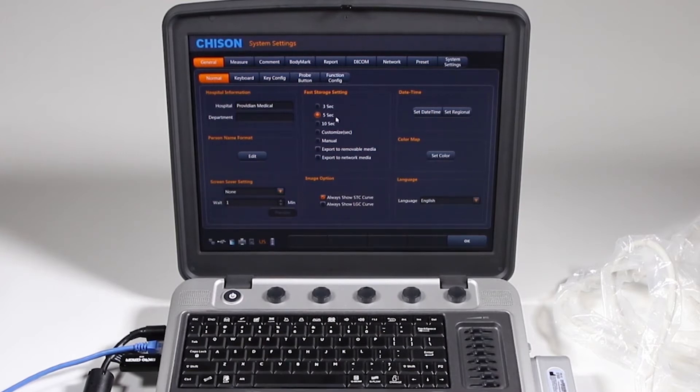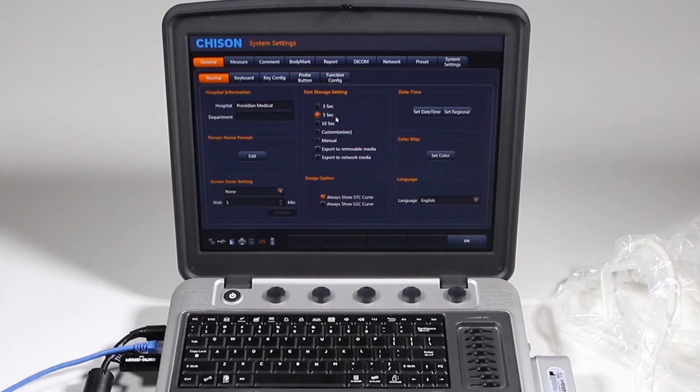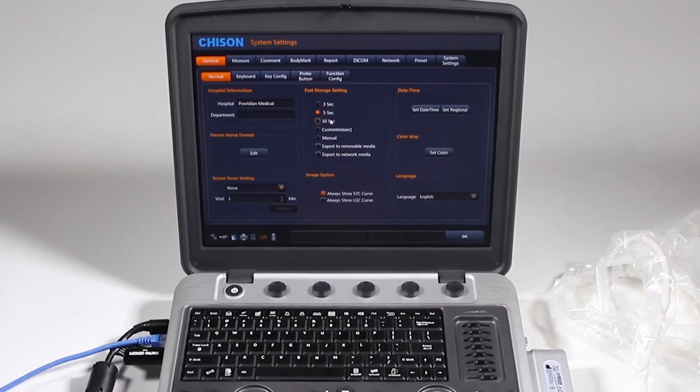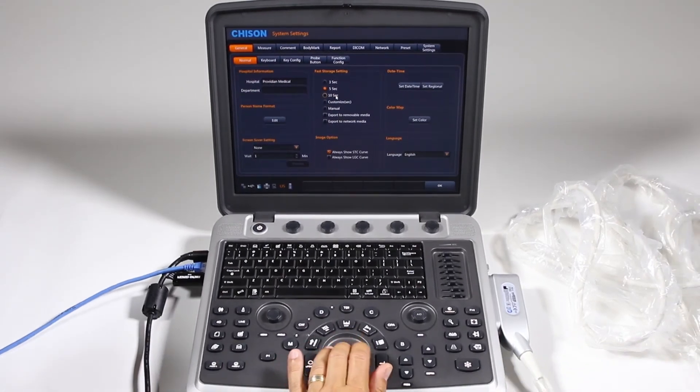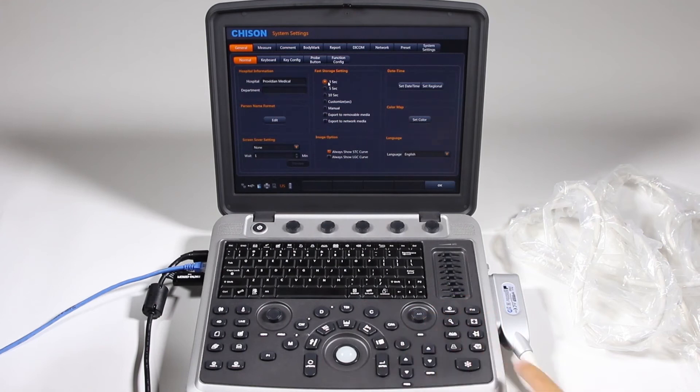Now this fast storage setting is for use during the CINE, like a prospective saving. Each time you hit that, it'll go for three seconds, five seconds, or ten seconds. So if you're in a cardiac exam and you're doing all prospective saving, you can set it to three seconds.